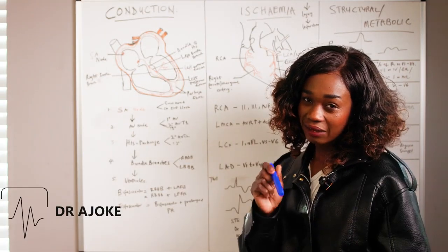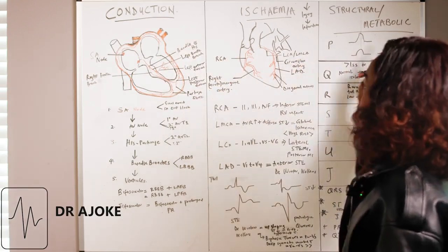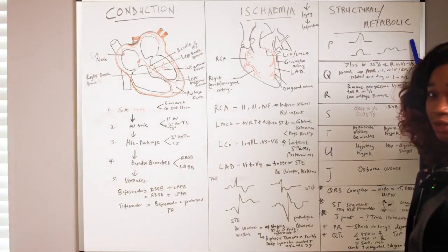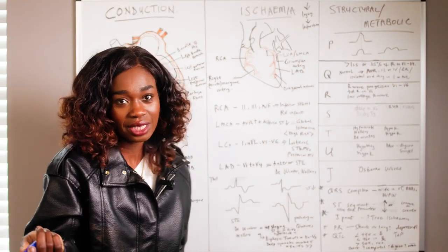Any ECG that ever lands on your desk will fall into one of these three buckets. Either it's a conduction problem, or it's an ischemia problem, or it is a structural or metabolic problem. And you can literally rehearse this anytime you see an ECG.